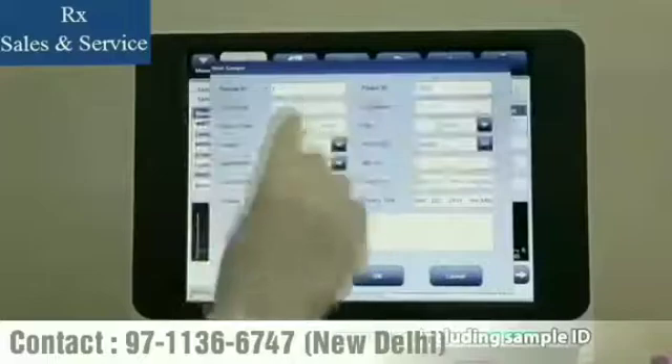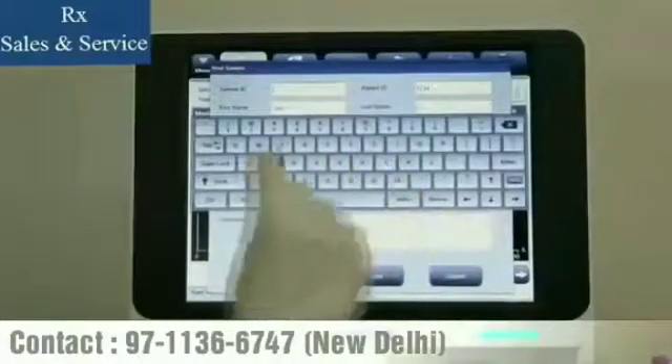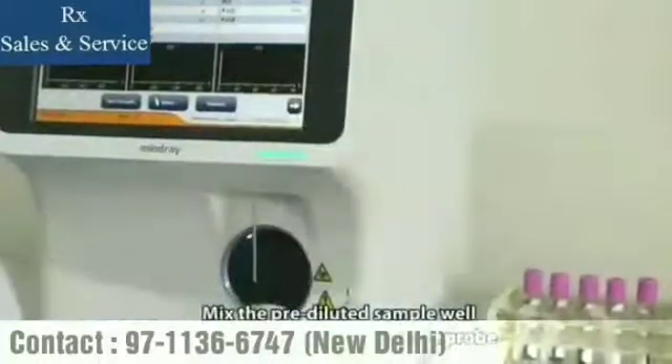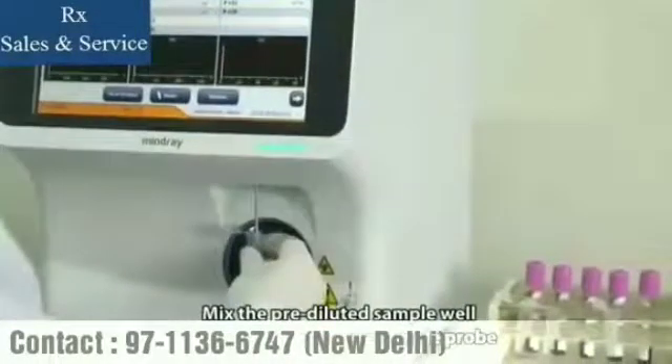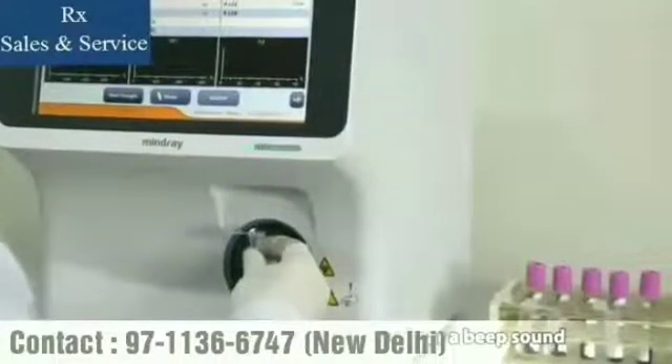You may enter the sample information including sample ID, name, age, gender, and so on. Click Mode and change it to pre-dilute mode accordingly. Mix the pre-diluted sample well and run it through the sample probe. Remove the sample tube after you hear a beep sound.